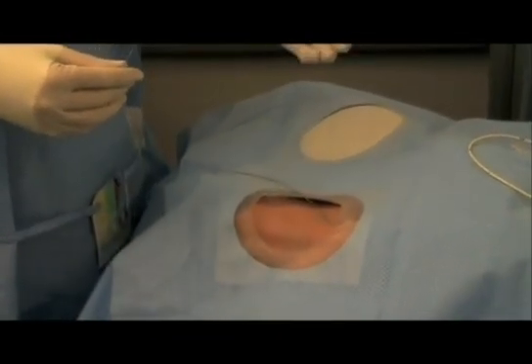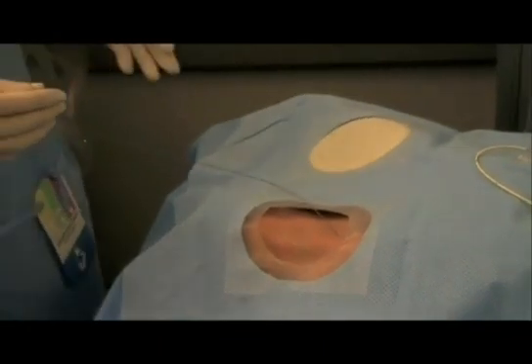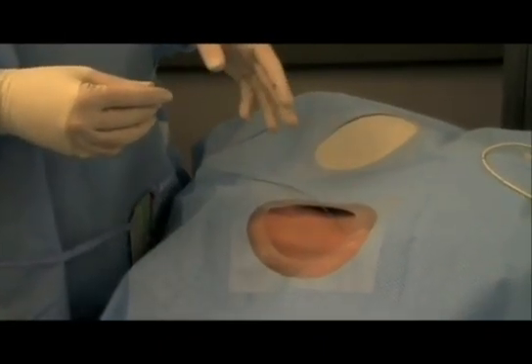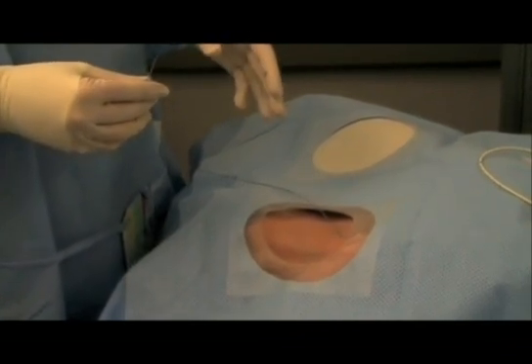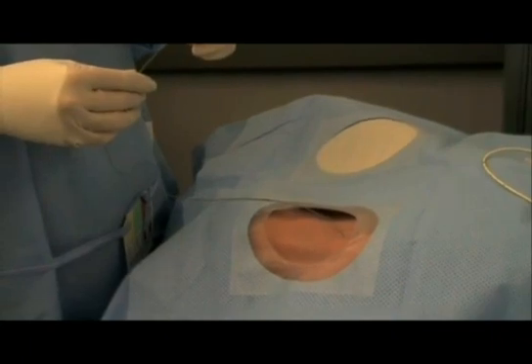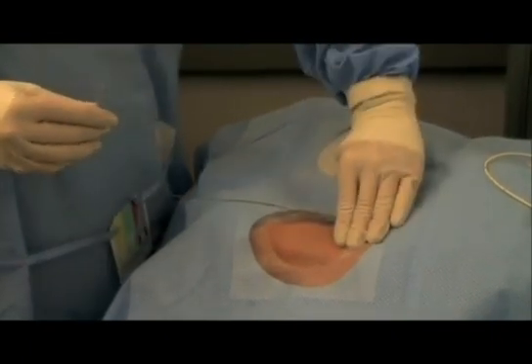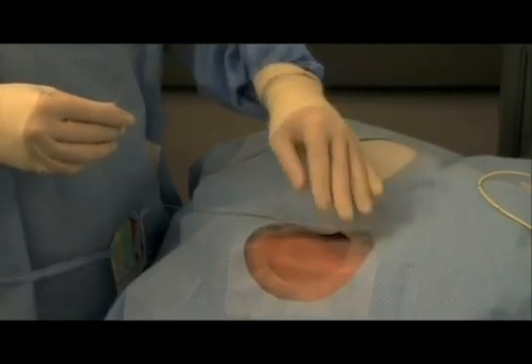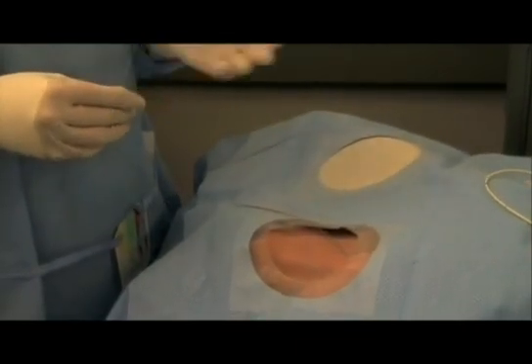If you had arterial flow, what I recommend doing is leaving the angiocath there, putting a cap on it, taping it off, and calling the vascular surgeons to have them decide whether they want it pulled or not. Hold pressure over the site to make sure a hematoma is not forming and get some advice. That's really the safest way.